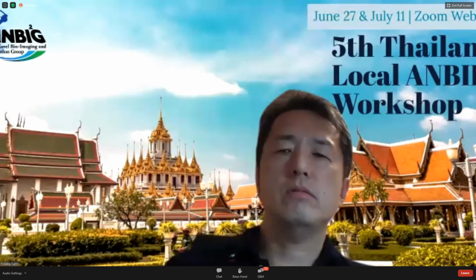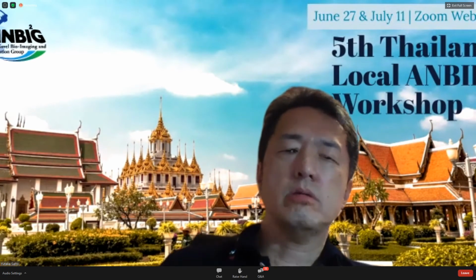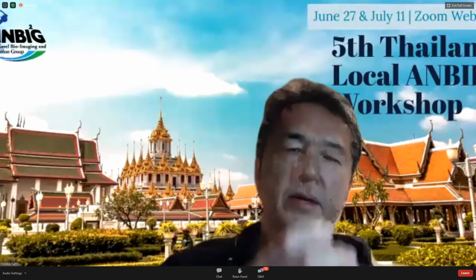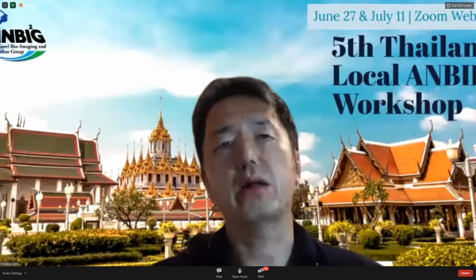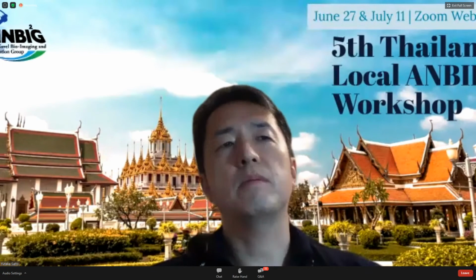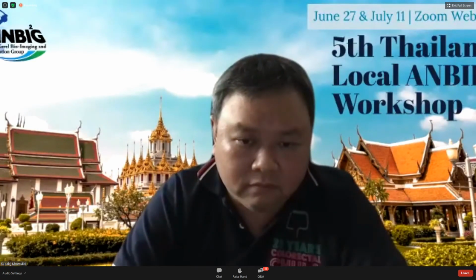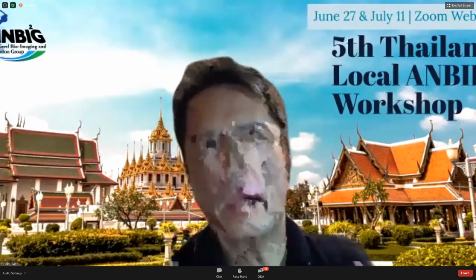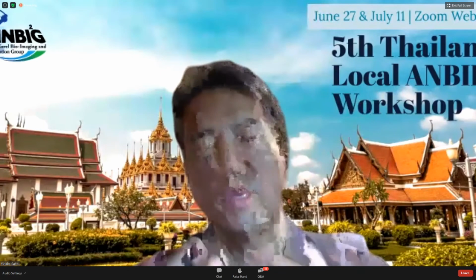Yes. As usual, the time is limited even for the observation. So I try to focus on the suspicious area, such as a depressed area, a depressed component, or a large nodule. I only focus on the suspicious area and magnify with NBI and the pit pattern. But sometimes I ask our resident doctor to perform the diagnosis before EMR or ESD. They try to magnify all of the lesion, but it is not practical. So in the white light image or non-magnified NBI, we should focus on the target area and then focus on the target area with magnification.